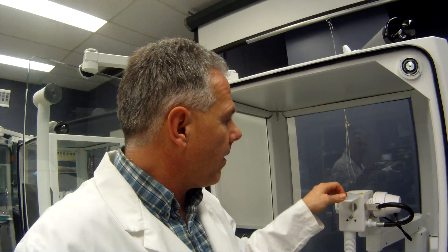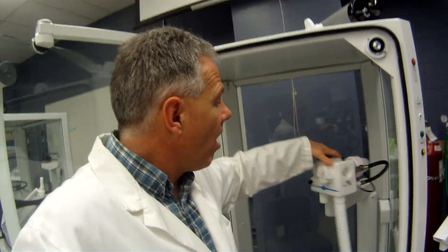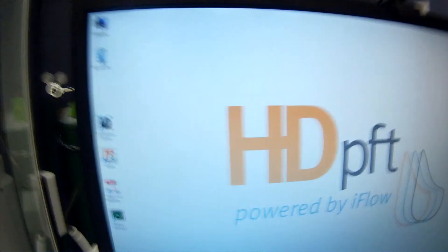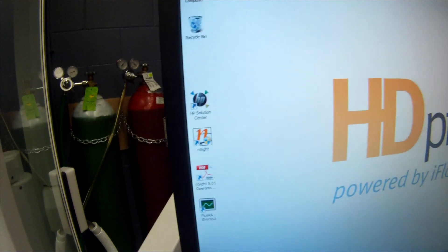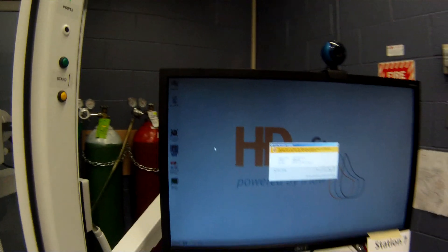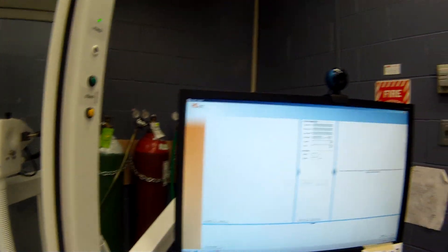So that's housed in this little unit here. We're going to show you how to do a calibration of the basic pneumotach here. Let's get orientated to the software. We're going to use the Insight software to do this, so just get this going and fire it up here.